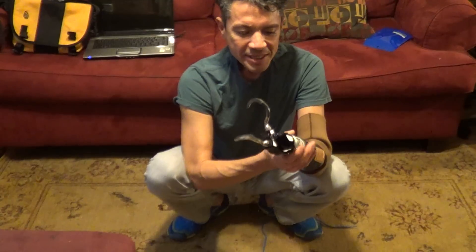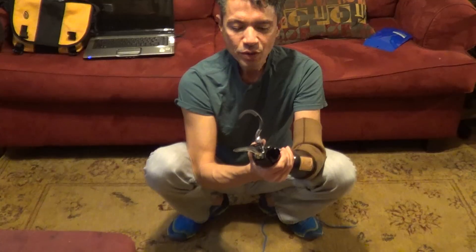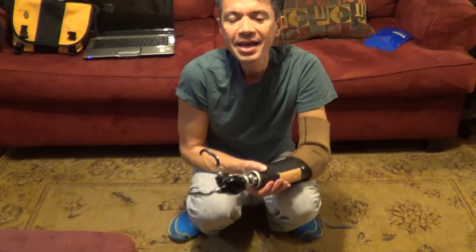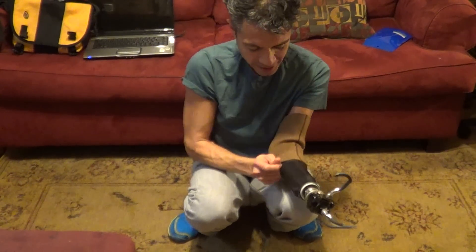Hey everybody. I decided I'm going to film myself tying my shoes just to show really that I can do it and how quickly I can do it. But I've been practicing a lot with this today and my muscles are — maybe I've got muscle fatigue from trying so much.